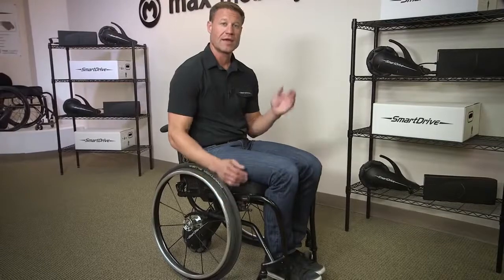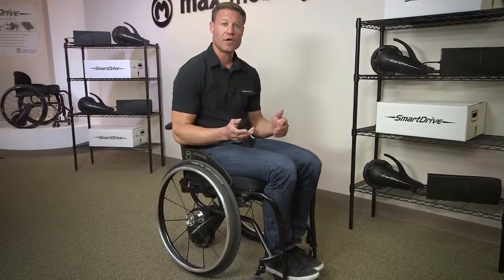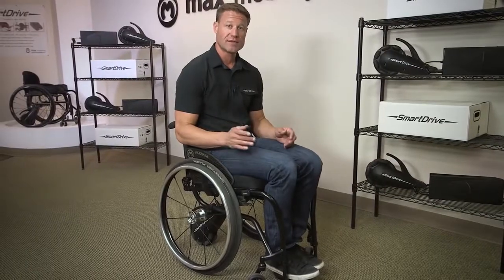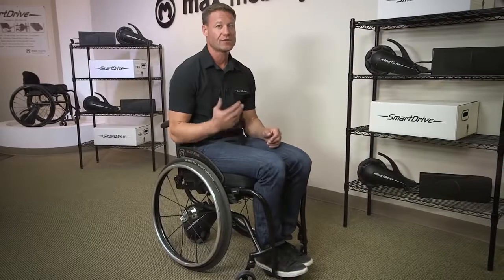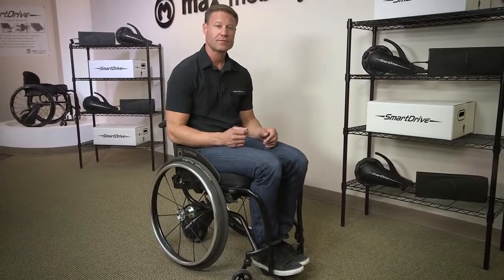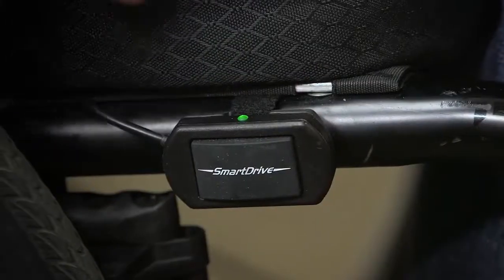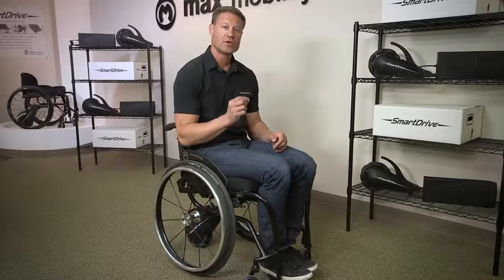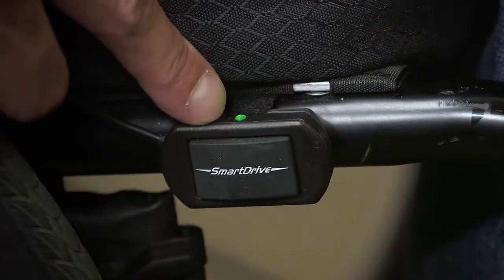There are 2 modes, indoor mode and outdoor mode. When you press a button to change modes, you do not need to hold it down, just press and release it right away. If you continue to hold it for 1 second, it will turn the SmartDrive off. The default mode when you turn it on is the indoor mode, and the light will be solid.